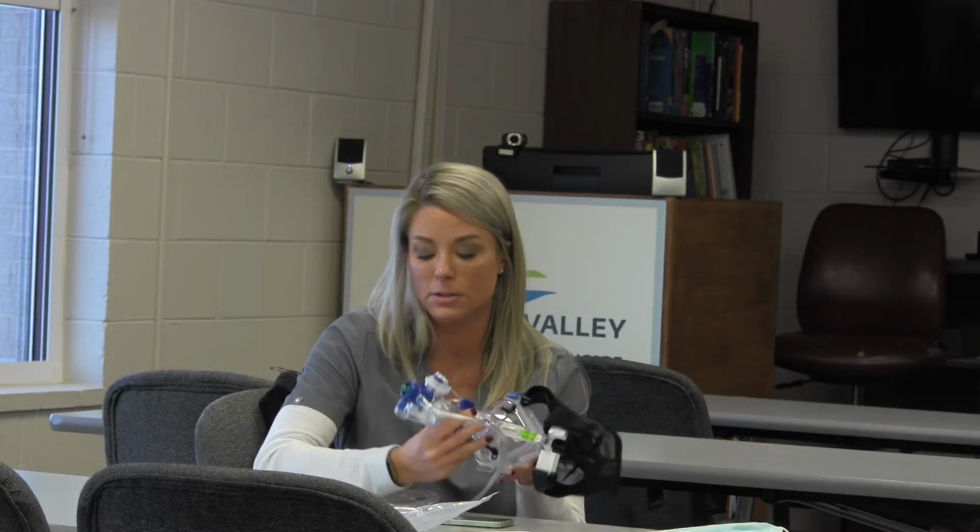I think the flow setting should be 10 liters or 8 liters per minute. But I'm not sure, so we'll just have to look at the policy on that. Depending on what your patient needs, you can always look at this little blue thing here as well. So it's pretty straightforward that way.